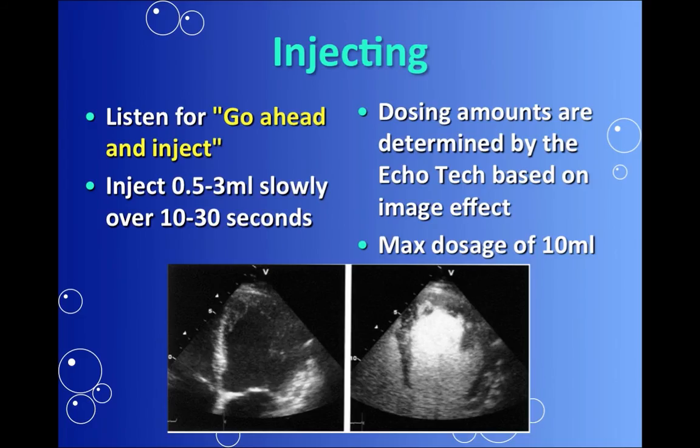When you draw it up, use a 10 ml saline flush syringe and expel about 1.5 mLs, and use a vented spike, or a large gauge IV, to draw up the Definity into the syringe. If you don't have a vented spike, which you can get from Central, you can use another large gauge IV to spike the vial as you draw it up. Then hand agitate the syringe to mix it well.